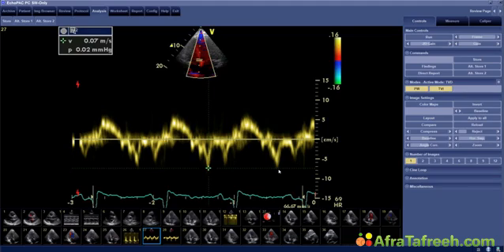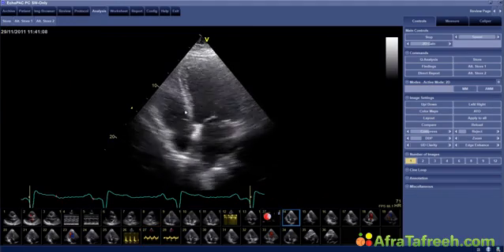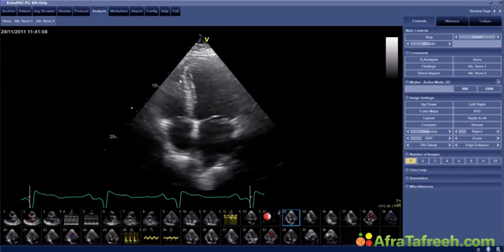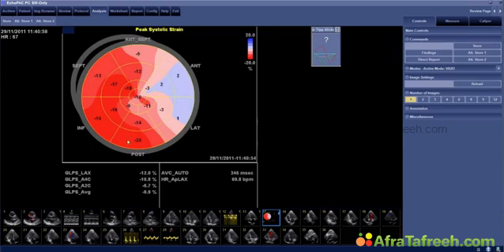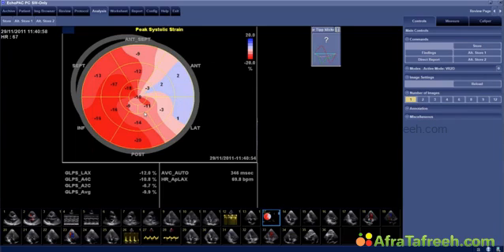With respect to the question that Emmanuel asked, if a tissue Doppler can also be used to look at the wall segments, well, yes, actually you can. It is more cumbersome because you would have to place a tissue Doppler sample volume into the different parts of the myocardium and look at how high the peak velocity is, and you can then determine if a segment has a reduced contractility, and you can also look at other things like post-systolic thickening. It could be done. But the nice thing about the speckle tracking certainly is that it is much, much easier. You can just do that with a few clicks. You get this bullseye display, and then you know exactly what is wrong.